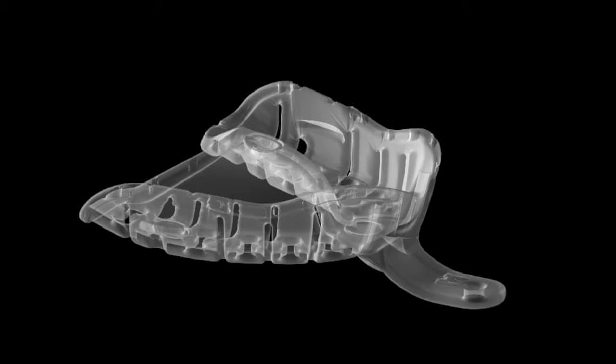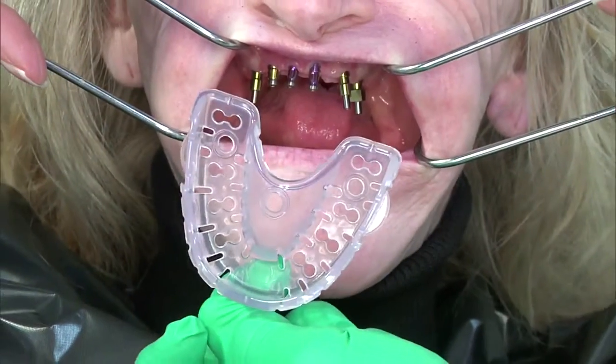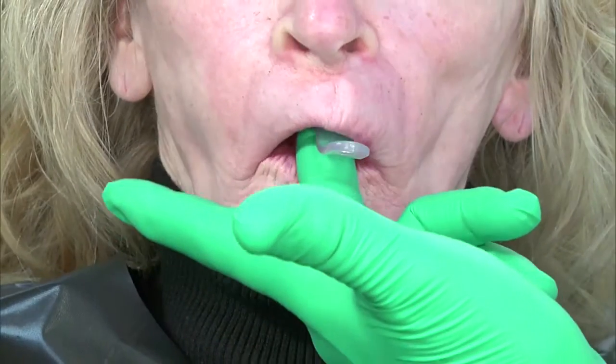Prepare your patient for insertion of the heated tray and assure them that the heat will dissipate in 5 to 10 seconds. For the maxillary arch, the use of cheek retractors will allow for rapid placement of the tray into the oral cavity. Quickly place the tray in the mouth. The operator will place a finger in the palate, seating the tray, and the retractors are removed.